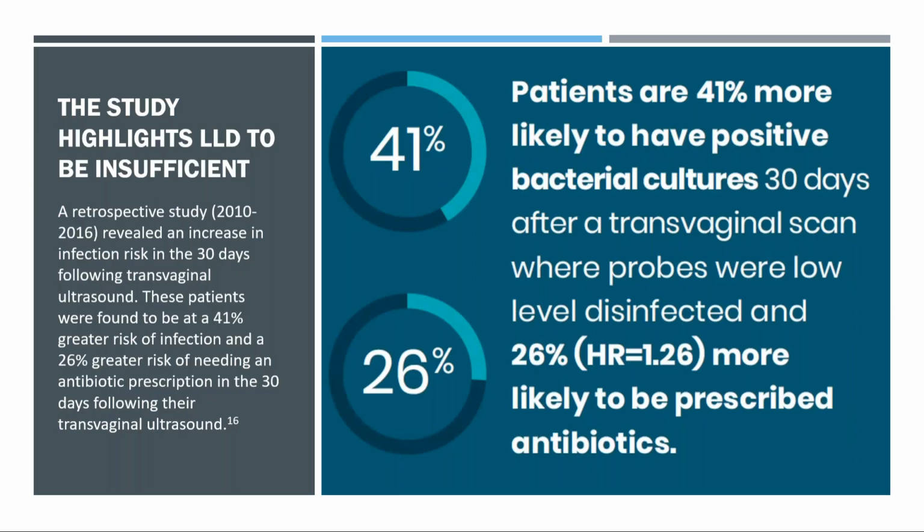A retrospective study from 2010 to 2016 revealed an increase in infection risk in the 30 days following transvaginal ultrasound. These patients were found to be at roughly 40% greater risk, and a 26% greater risk of needing an antibiotic prescription in the 30 days following their transvaginal ultrasound. So we've noted here that this is quite important.